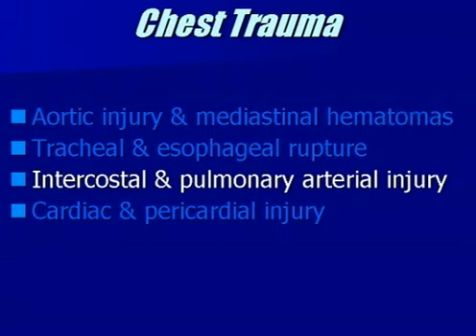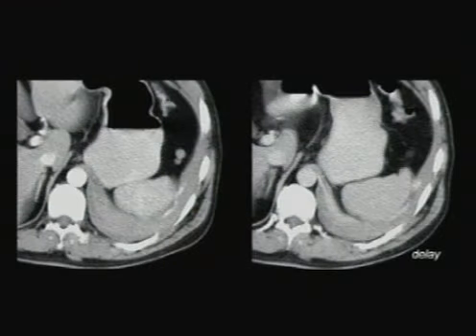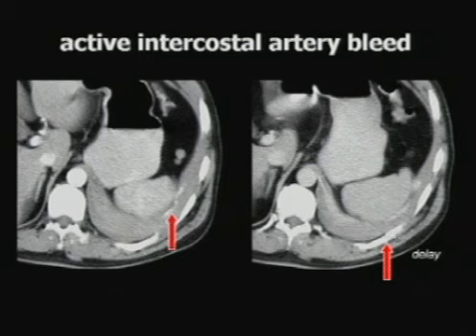So we'll switch now to a couple other vascular injuries that can occur. These are a little bit less common, intercostal and pulmonary arterial injuries. This is a case we had, we can see it's our initial phase of CT and our delayed image over here where our contrast is washed out from the aorta, and you'll see why I did this. We've obviously got a dense hemothorax present on the left side. There is a contrast blush that's tracking through here. On delayed images, we show that this contrast has expanded and diffused itself through to show us that this is actively bleeding. There's the fracture, so this is an active intercostal artery bleed.